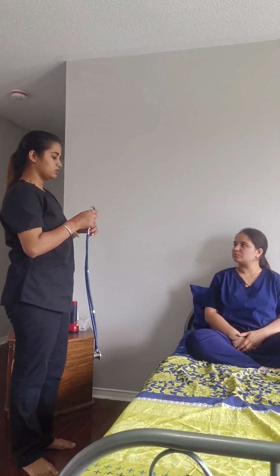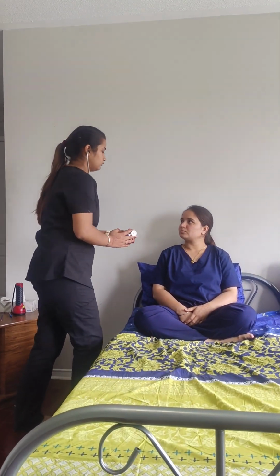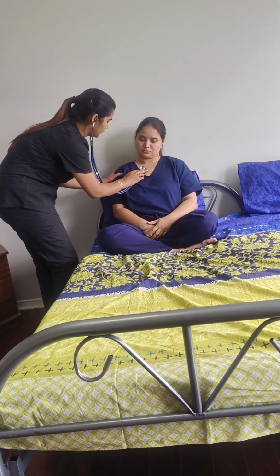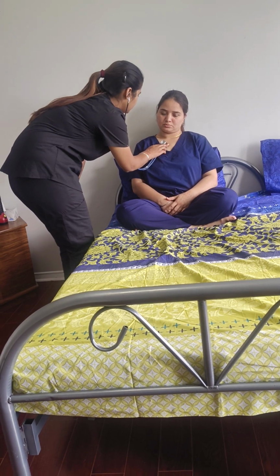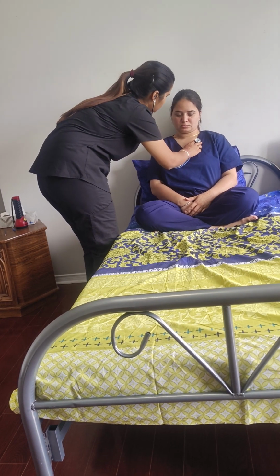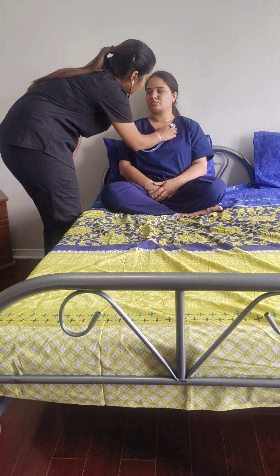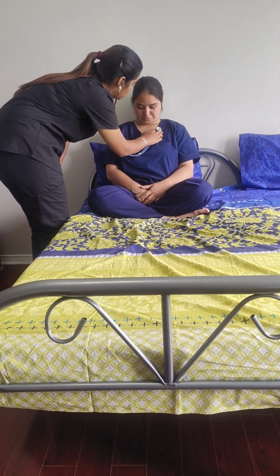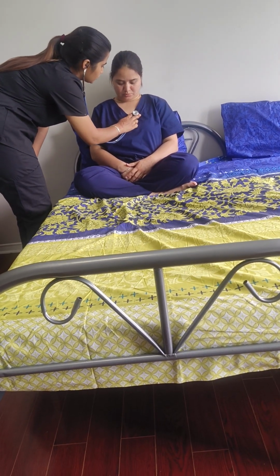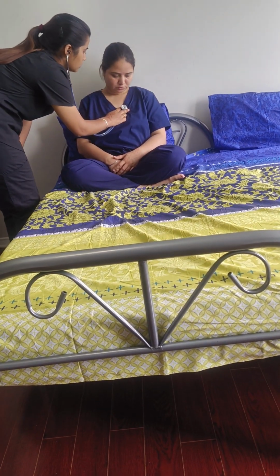In this, I'm going to assess five different places, starting from the apex of the heart to the aortic valve, which is situated at the right side of the second intercostal space, and I'm going to hear the S2 sound. Continuing with the pulmonic valve at the second intercostal space, similarly I'm going to hear the S2 sound over here. Now at the left side on the third intercostal space, I'm going to check for the Erb's point, in which I'm going to hear the S1, S2 sound.